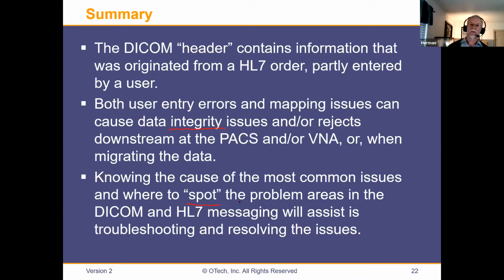A reason for study, and then patient weight. If you know about the 10 or 15, and we have access to the interface specification, you know exactly what to do if there's a problem, right? Okay, so that was kind of in my conclusion.